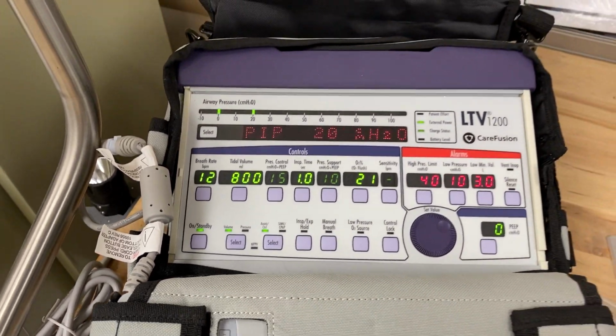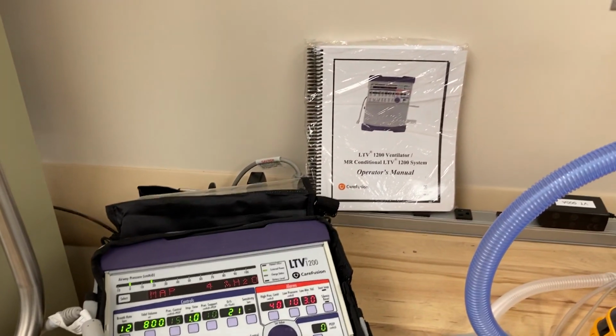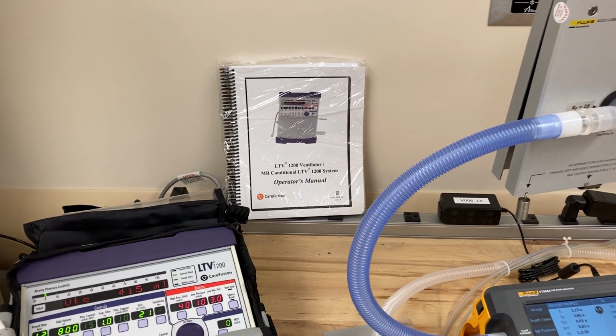Sensitivity's turned off because that's what would be recommended if you ever had to do this and put two patients on a vent at the same time, which would only be done as a last resort.